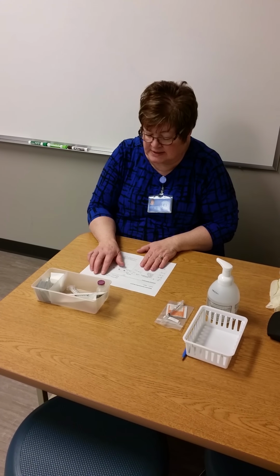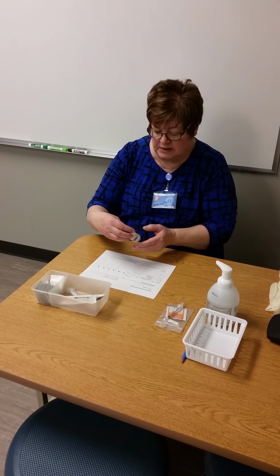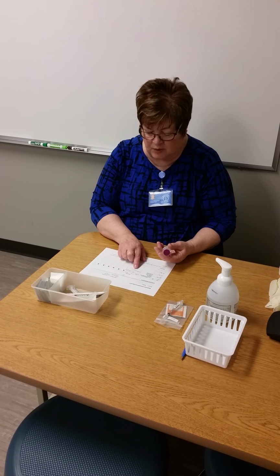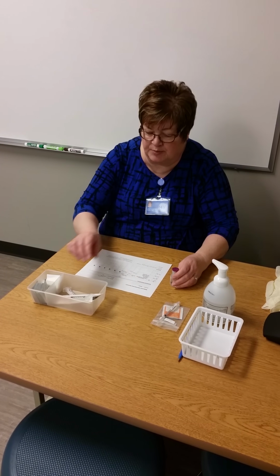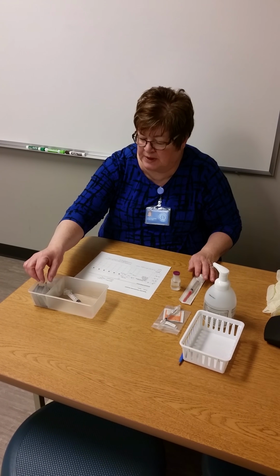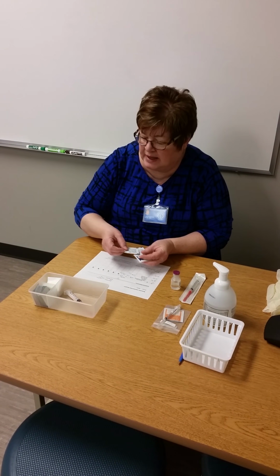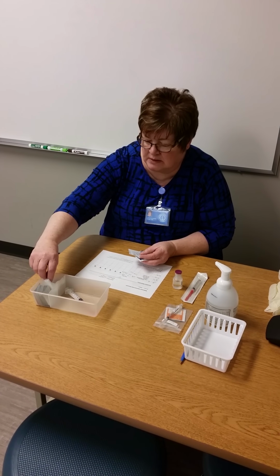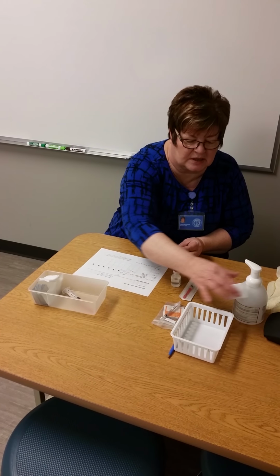Next medication, Casey Banks, 10-2-1965, sterile water. Sterile water for injection, 1.5 mls at 0900, and it has not been given on today's date. So now I'm going to be pulling out the remainder of the equipment I need. I need a 3 ml syringe with a blunt fill needle. I need 3 alcohol pledgets, and I'll be using a cotton swab for later on. So I'll be applying things to this cart.